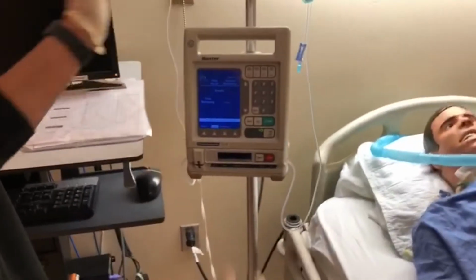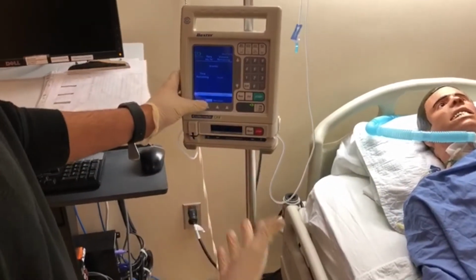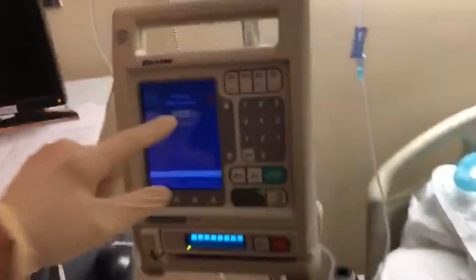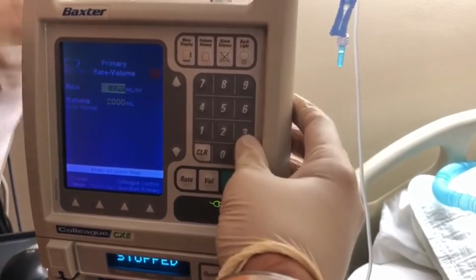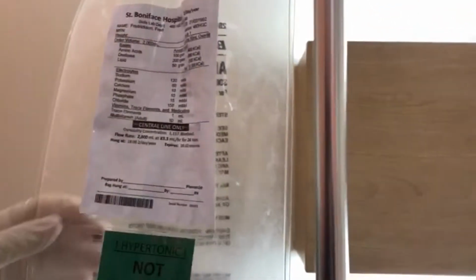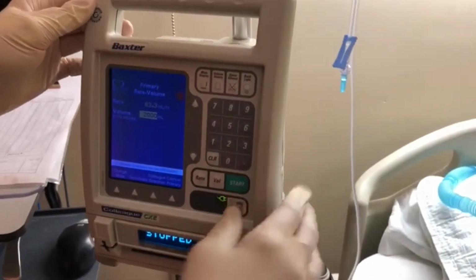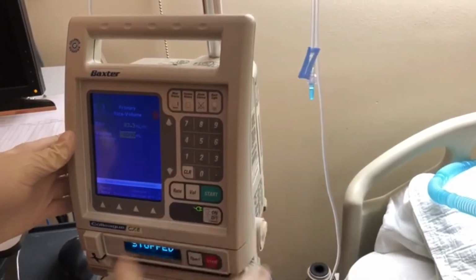Now what we want to do is attach our thing. So before that, we have to set our infusion. We know that it's primary, and we're going to have it at 83.3. I could just re-enter this, 83.3, and we know from this that it's the full 2,000 mLs, which is here as well. So 2,000 mLs. That's good. We have that. We can confirm the primary.